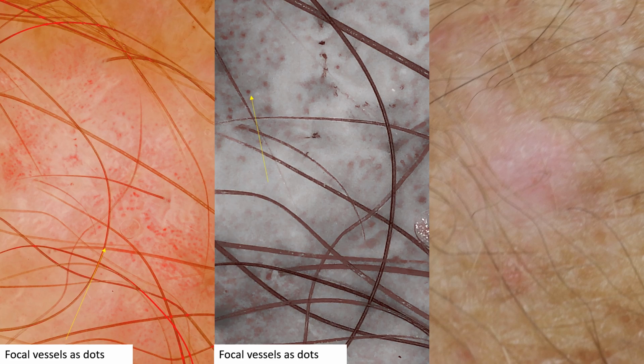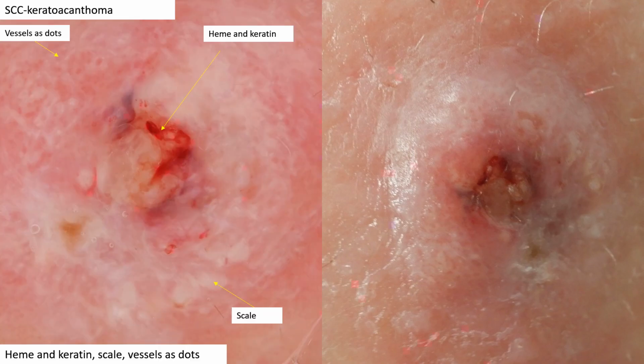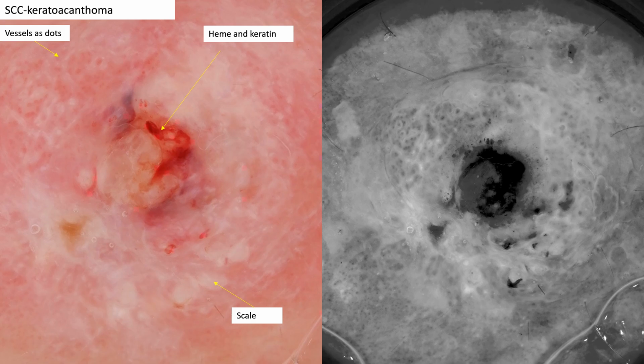This scale is obscuring the underlying vasculature. Now, this is a keratoacanthoma, a rapidly growing lesion. Dermoscopically, it has many features. It has scale, it has heme and keratin, and vessels as dots. We can also see these vessels as dots in the near ultraviolet light, and the central portion is essentially in black and white, a scale crust.